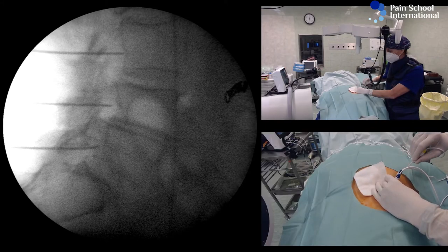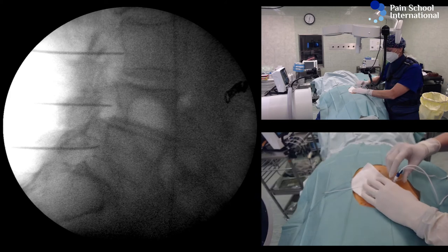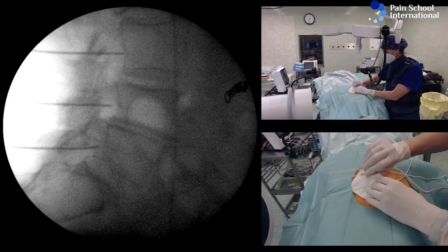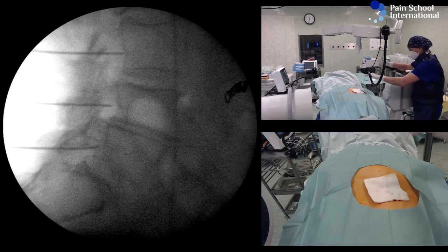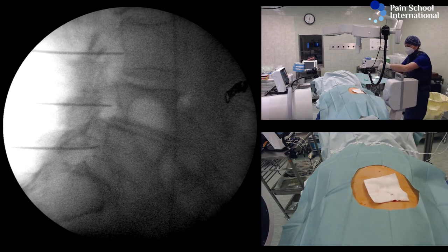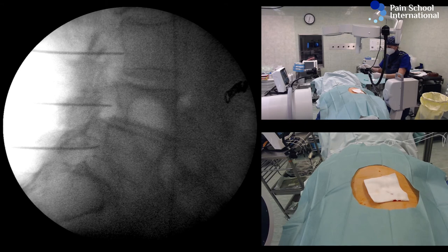With this, the procedure is complete. The cannulas can come out and the patient can expect pain relief — sometimes fast, but sometimes up to 3-4 weeks after the procedure.